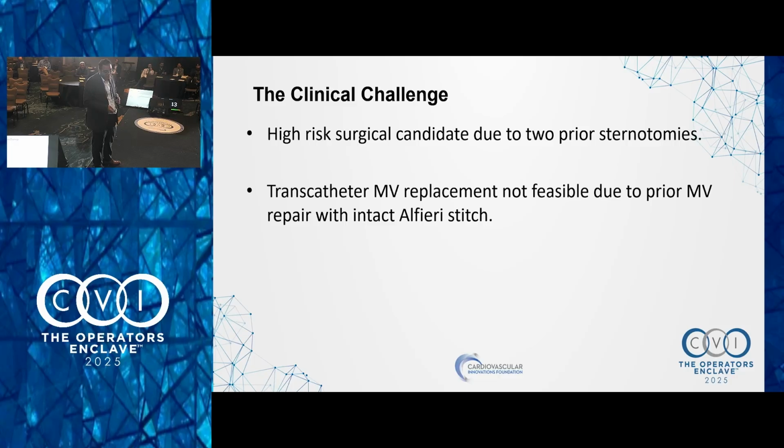The other thing is, can you just put a clip in there in the commissure? I would say that should be your first strategy. The nice thing about a commissural clip first is that you go there first and if you don't like it, then you put a plug between the clip and the Alfieri. And you have a pair of goalposts. Yeah. I mean, these plugs post-clip have not done that well, generally speaking.